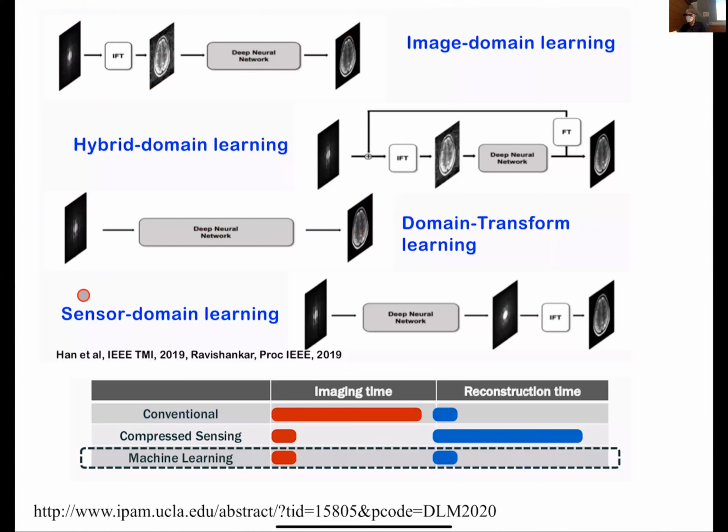You could do something where you have your K-space data and you stay in K-space, but deep learning cleans it up and then you do the inverse Fourier transform. Or you can do a hybrid approach where you take some of the Fourier data and go right here and then clean some of it up, do an inverse transform, get some artifact image, pass it through a deep learning network, and you would get that image. So people are still experimenting with these different approaches. But clearly something like this is the most straightforward.